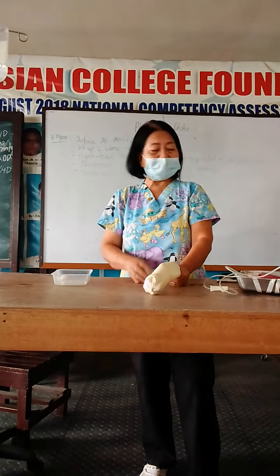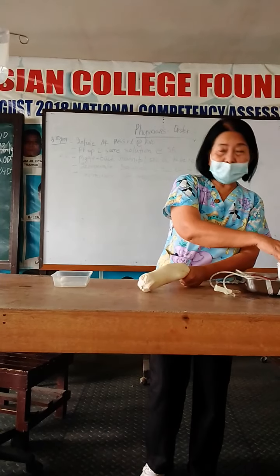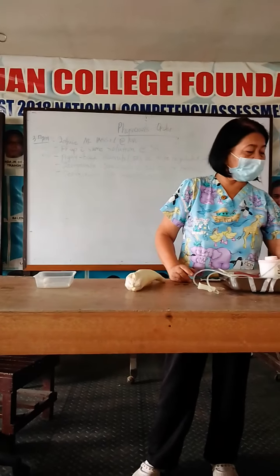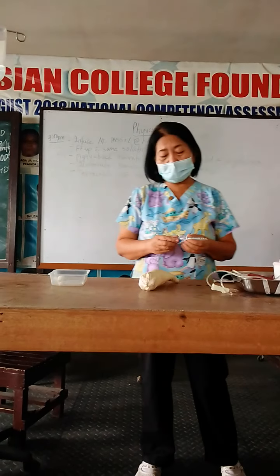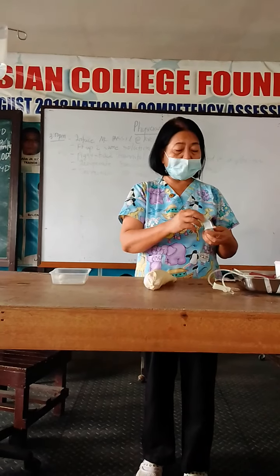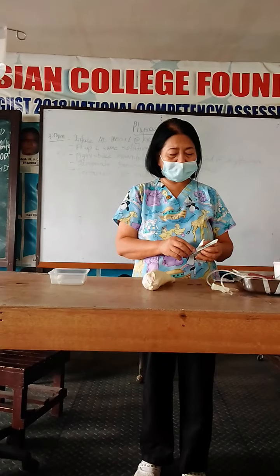Okay? So it is in the vein that you insert, not in the artery. Do not insert IV in an artery class. We are inserting IV in a vein. Okay, so I already checked the packaging, expiry date, and also the vein. So I'm going to pick this one.